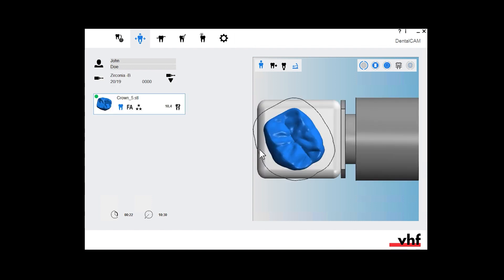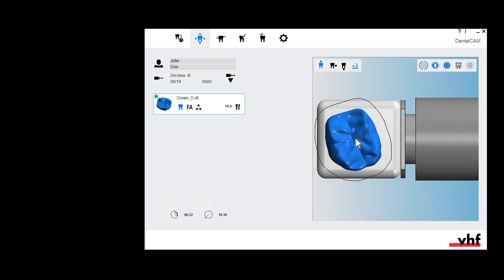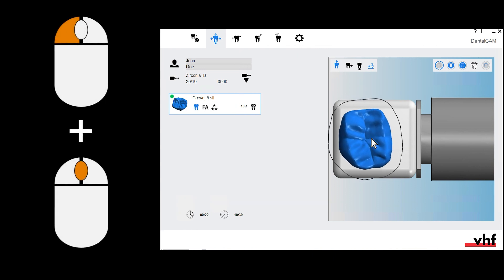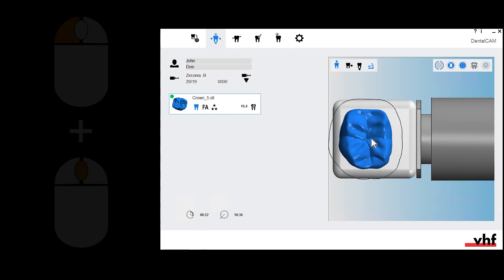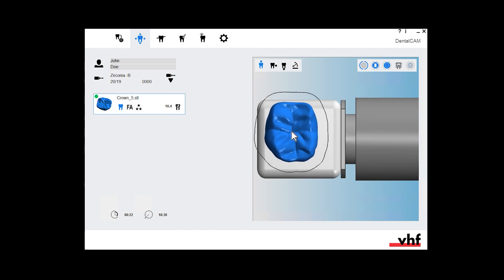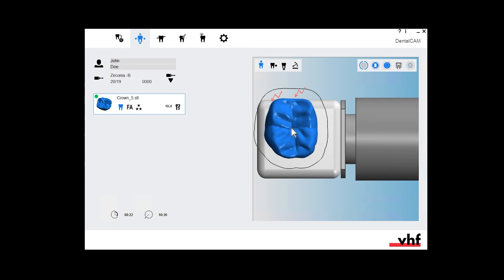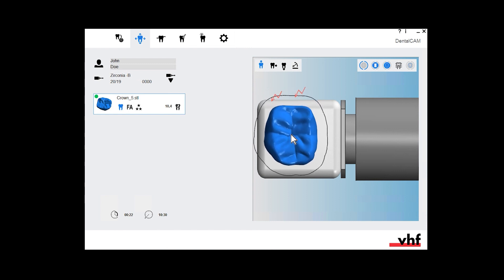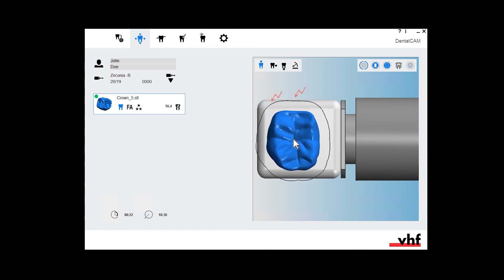To rotate the object, select and hold it in the blank display and turn the mouse wheel. To move the object, deactivate the placement aid. Select and hold the object and drag it into the desired position. If the object is too close to the block border, a red flash displays.